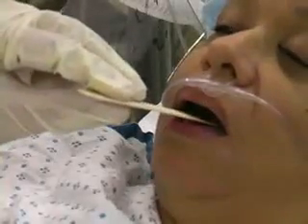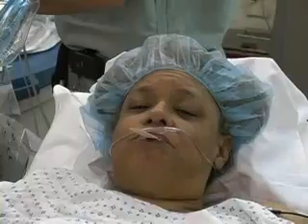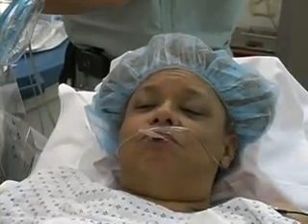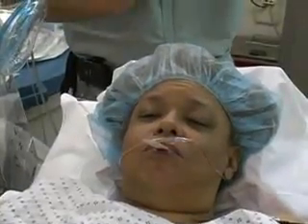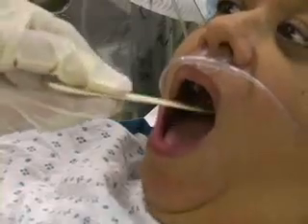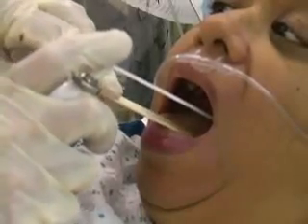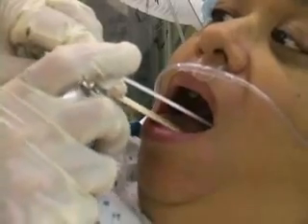Place the wooden depressor on the patient's tongue and ask him or her to suck on the stick. Every 1 to 2 minutes, as the patient tolerates, advance the tongue depressor into the mouth to anesthetize the tongue and posterior palate. When the patient can tolerate the tongue depressor at the back of the tongue, lidocaine spray can be applied to each palatine tonsil.